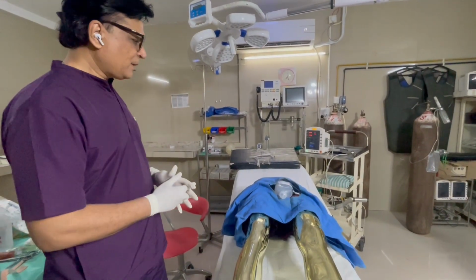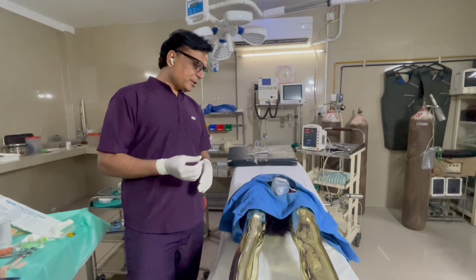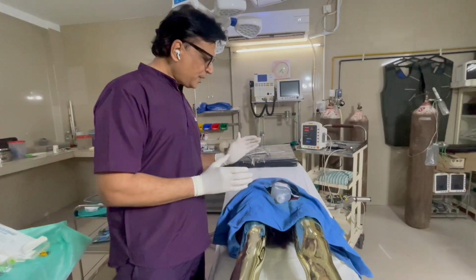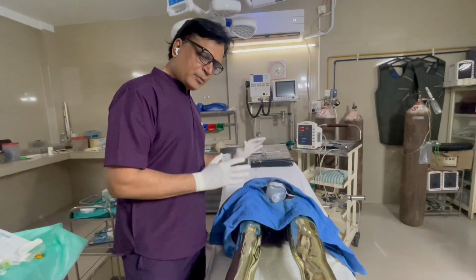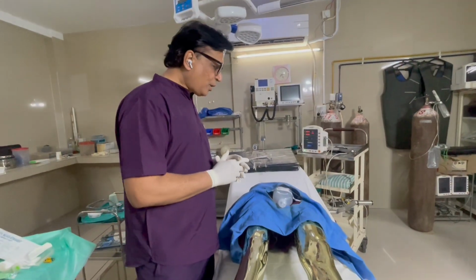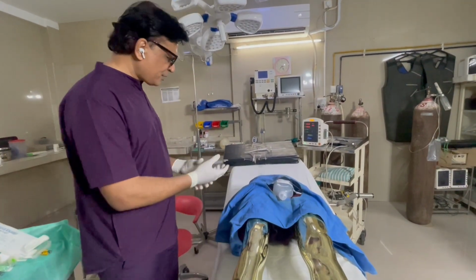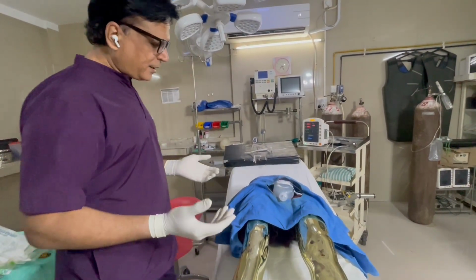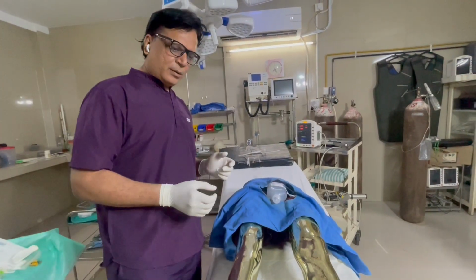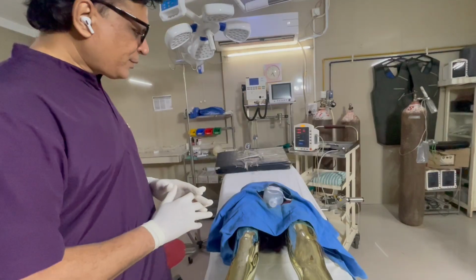So Mr. David, I will be putting one tube, that is a hollow tube, through your penis. So that will help to relieve the pressure or let the urine come out, which is trapped inside. So are you having any allergy? Let me check your wristband. Allergy to latex or something? Okay. If he says he's allergic to rubber, then we take care; if no, it's okay.